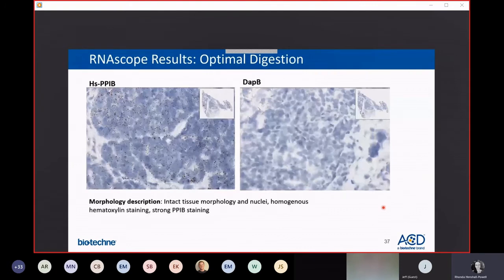On the note of pre-treat conditions and optimal digestion, I think this is easier to explain looking at just single-plex brown RNAscope chromogenic assay. Here, shown on the left, is the positive control probe PPIB, and on the right is the negative control probe DapB. The nuclei here are counterstained with hematoxylin, so they're purple. And again, this is single-plex brown RNAscope, so every dot corresponds with a transcript of PPIB.